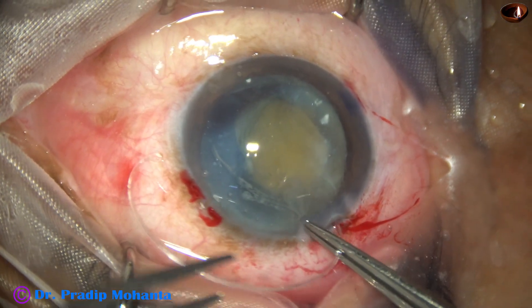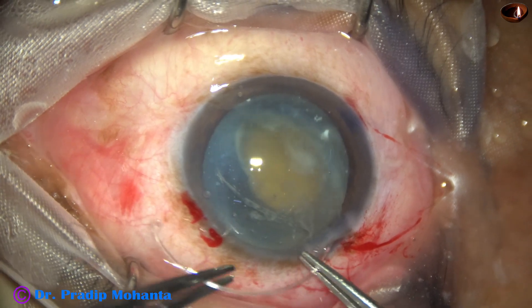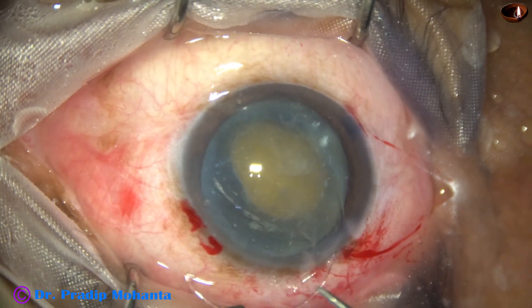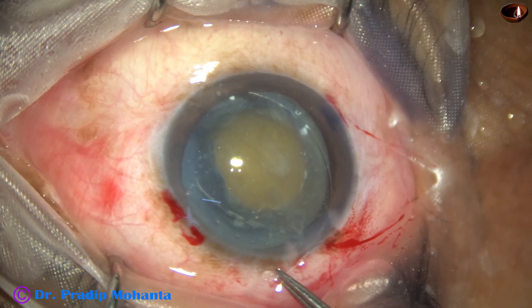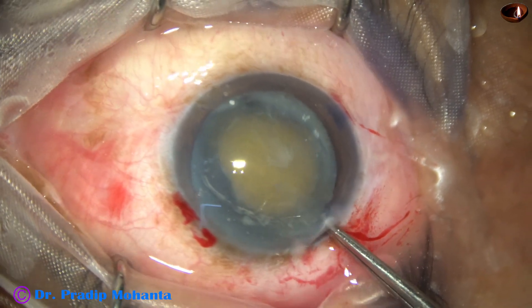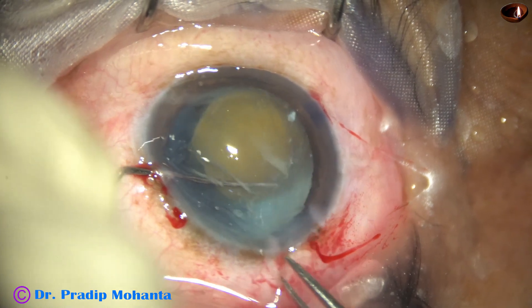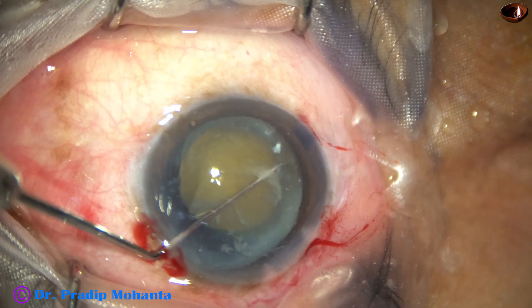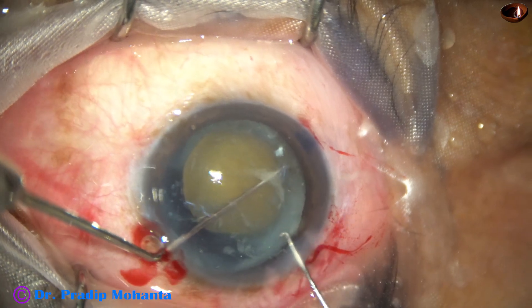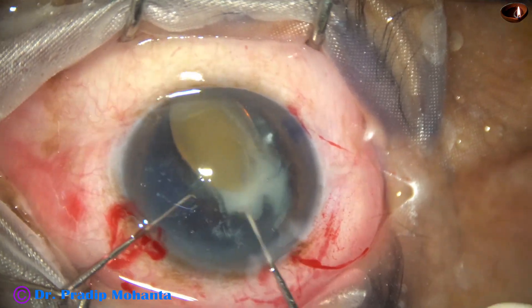I do not want to take any more chances without putting a capsular tension ring. So here goes the capsular tension ring. I usually put it through the incision with the help of a McPherson forceps and a tooth forceps. I hold the capsular tag very close to the trailing end of the CTR. I use a Sinski hook through the side port, and as soon as I go inside the bag, I find that I cannot release the trailing end. I take another hook and press over this hook and the capsular tag, and the CTR gets released.